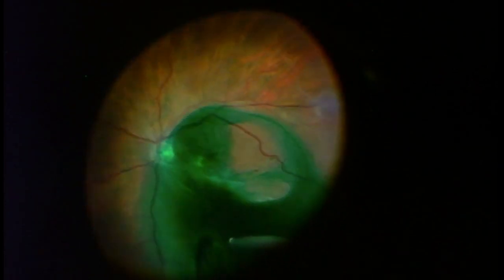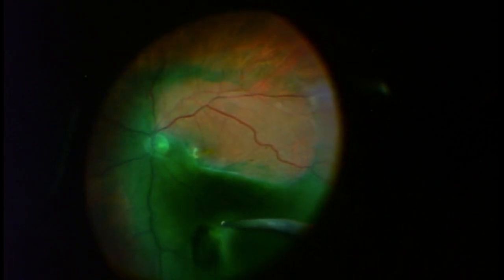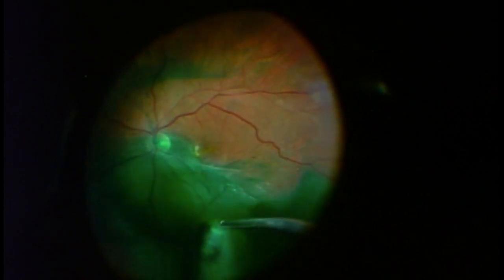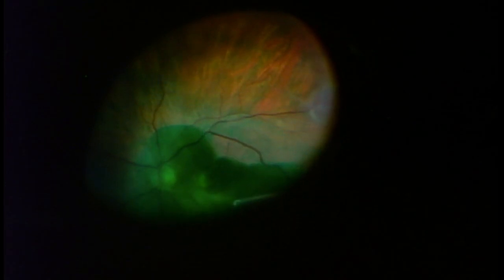The ICG dye is mixed with some dextrose, which is a sugar solution heavier than water. In this way, I can more specifically stain just the retina without the dye mixing all throughout the vitreous cavity.